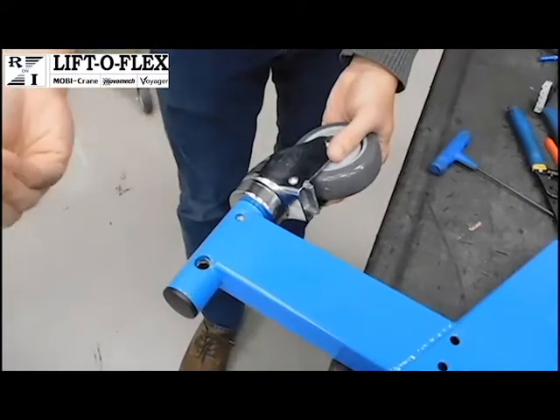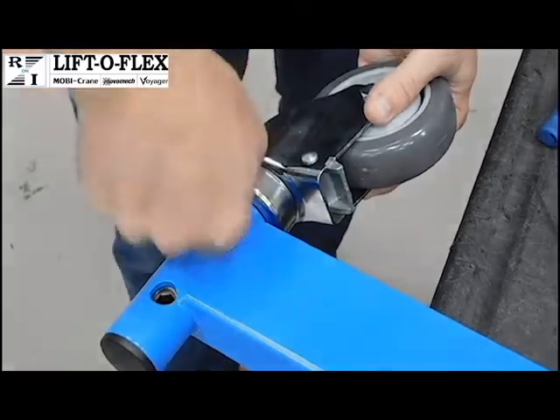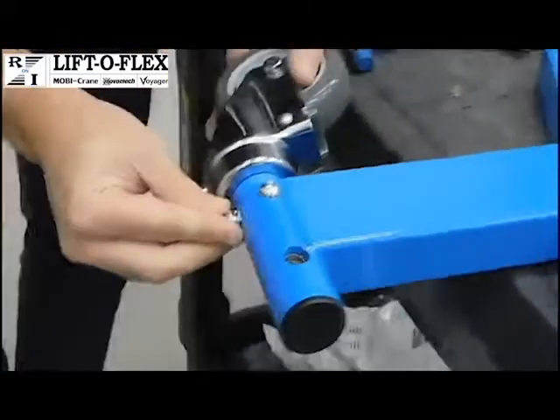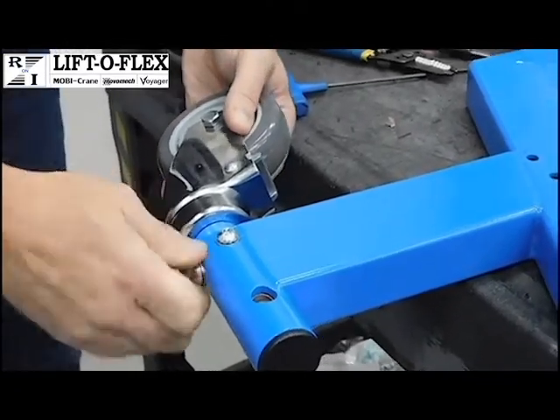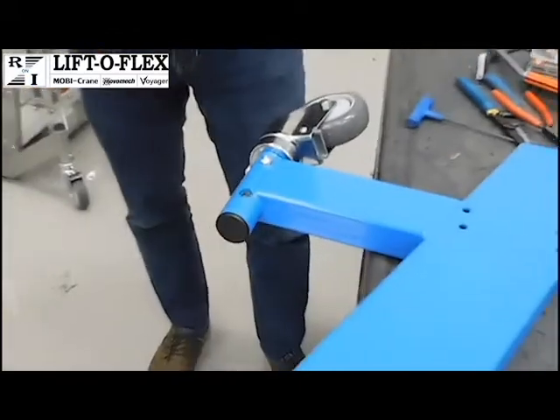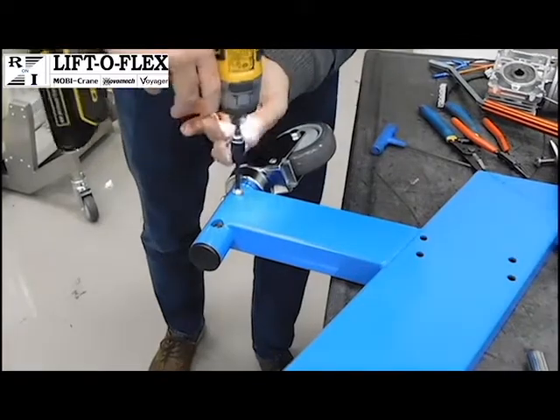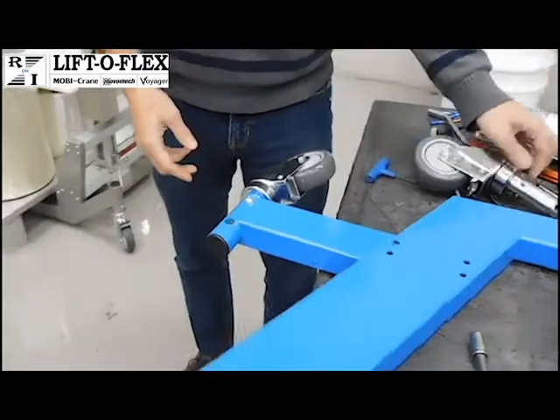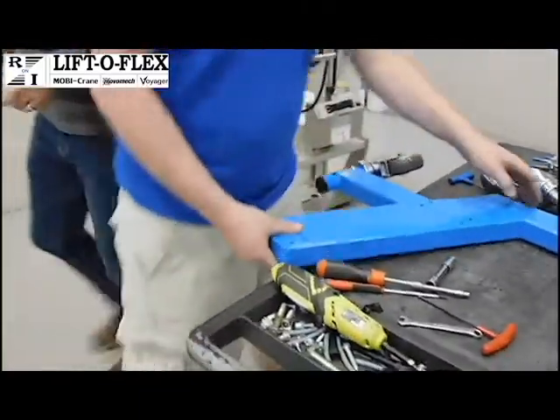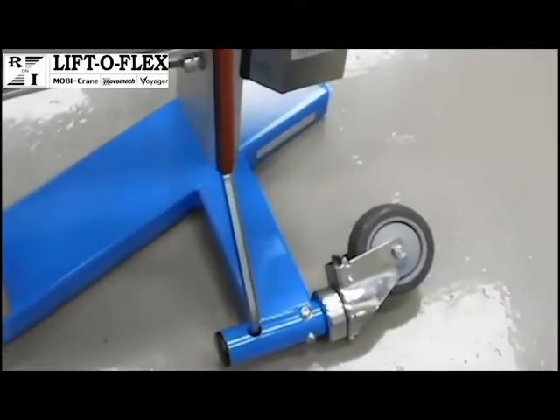All right, so when putting these in, start by hand, this avoids cross-threading of the threads, and the one on the back. And then either with the hand wrench or a torque wrench, it can be put back in. The leg is now ready to be put back on the lifter. To do this, you want to make sure the brake rod is back in the braked orientation, which is this position.